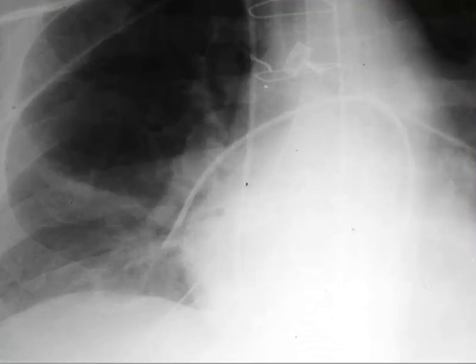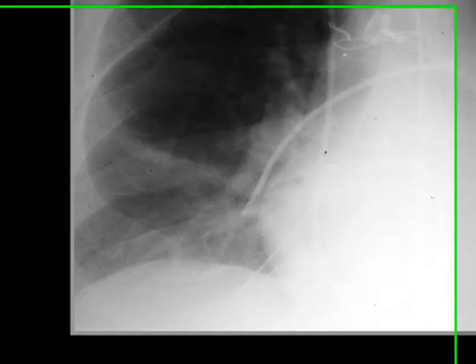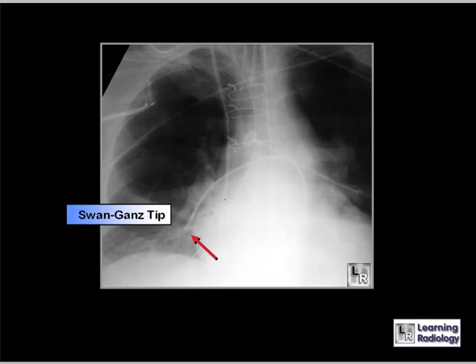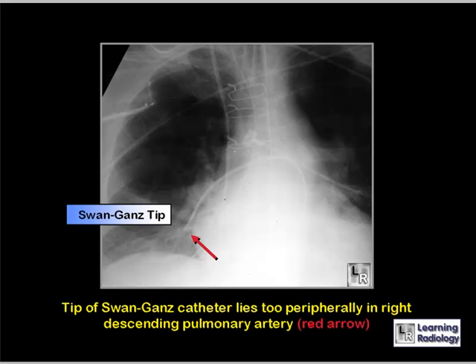What could be better about the placement of this Swan-Ganz catheter? The tip of the Swan-Ganz catheter is in the right descending pulmonary artery — it's a little too far out peripherally. Ideally, the tip should lie about two centimeters from the hilum in order to avoid the risk of occlusion of a branch vessel.